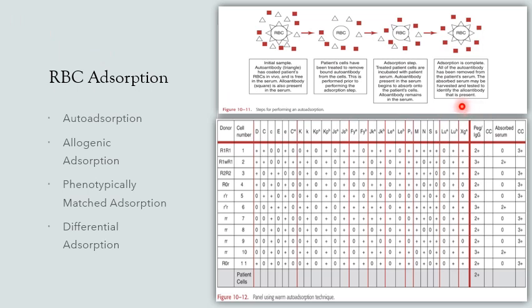After incubation, so adsorption is complete. So we could now harvest the serum or plasma and test for DAT negative autologous cells. If the DAT shows a positive reaction, do further adsorption using new aliquot of autologous cells. If negative naman, proceed to antibody identification testing.